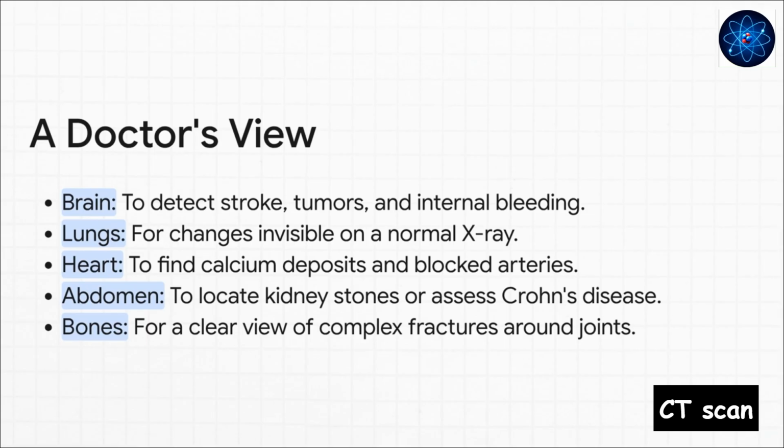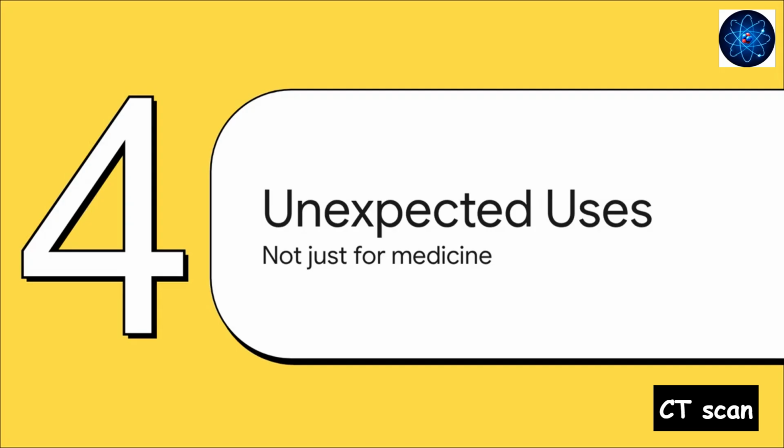And in the abdomen, they can pinpoint kidney stones, assess inflammatory conditions like Crohn's disease, or stage the extent of cancer. It even provides a crystal clear view of complex bone fractures. This tool gives them a level of detail that was once pure science fiction. But here's where the story takes a really cool, unexpected turn. This technology is so powerful, it's actually escaped the hospital.